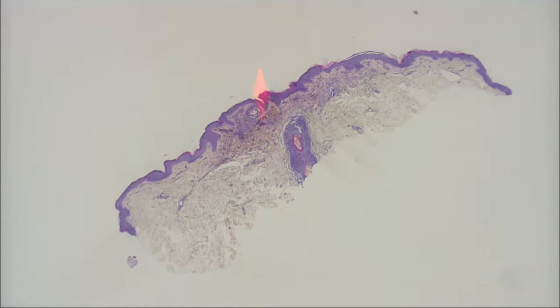So what else? It's small. Is it symmetrical? Yes, it's very symmetrical. Is it well circumscribed? Yes. So based on that, it's almost certainly going to be benign. Correct. It doesn't have to be. There are exceptions to every rule. I don't want you to think that everything that's small, symmetrical, well circumscribed is benign. What's one quick example of something that can be small, symmetrical, well circumscribed and is malignant?